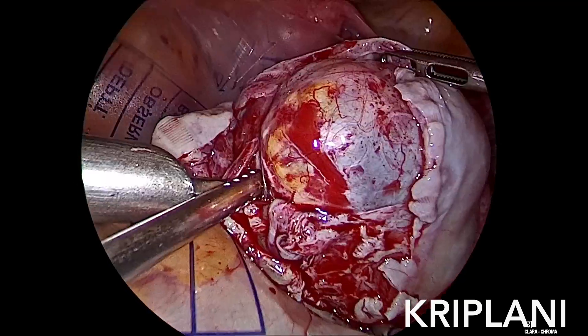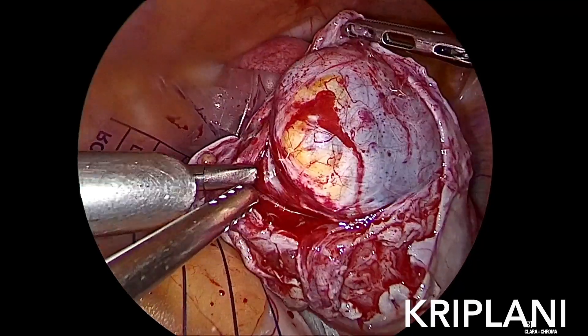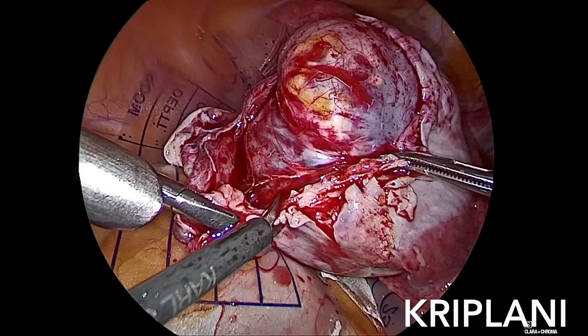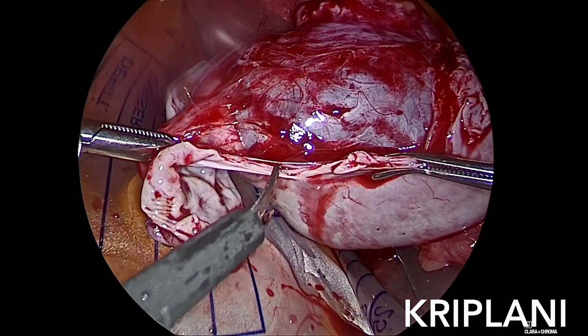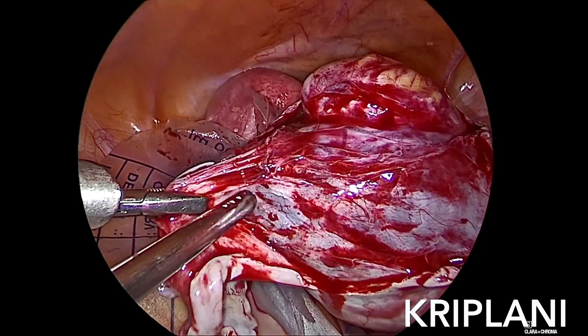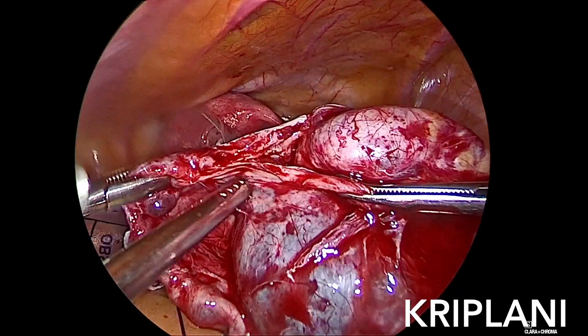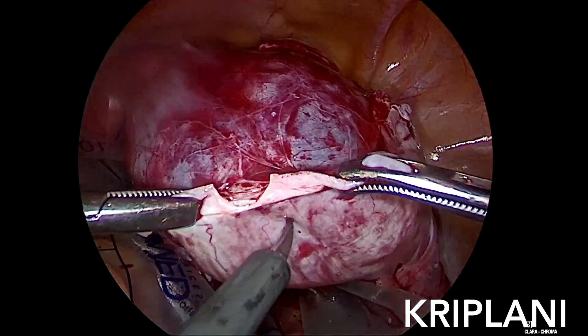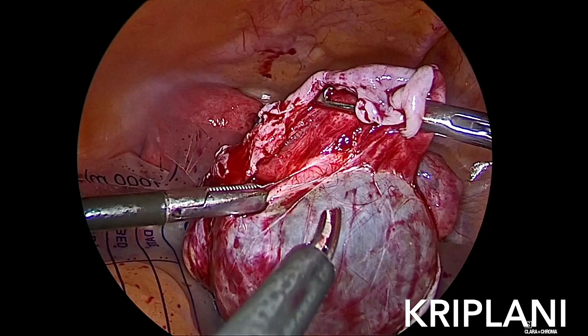Dissecting in the correct layer, these dermoids are lying like seeds in the ovary. So one can remove them completely, often without spillage and without damaging any adjacent normal ovarian cortex. Our aim is to avoid removing any normal ovarian tissue and to remove dermoids as intact as possible.